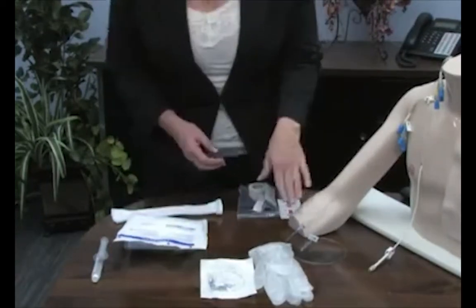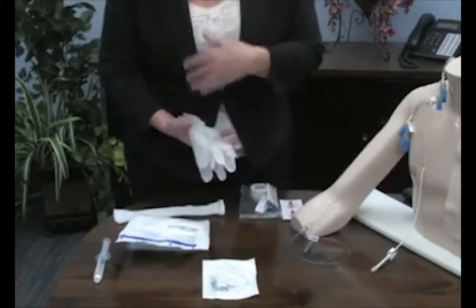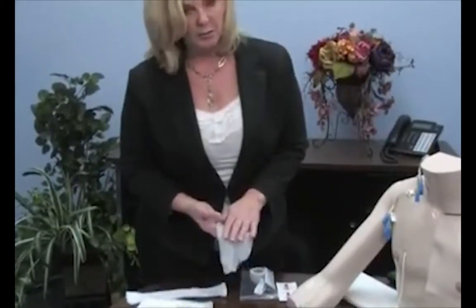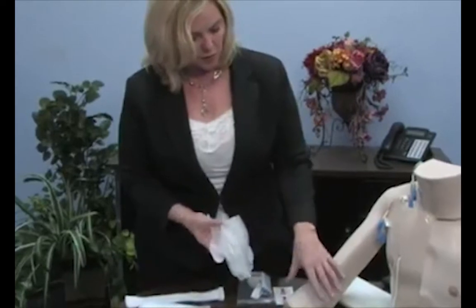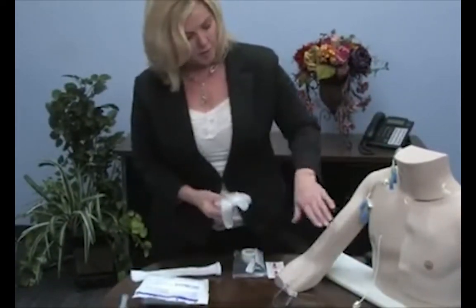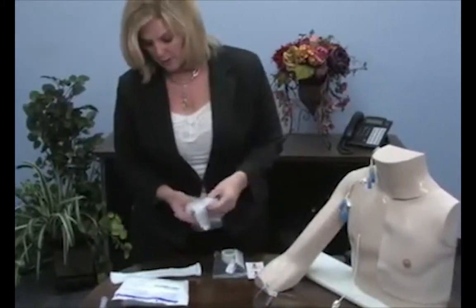So if this patient had a dressing on, I would, of course, wash my hands, talk to the patient about the skill that we're about to perform, and I would use my clean gloves in order to remove the old dressing off of the PICC line or the site here in the chest.